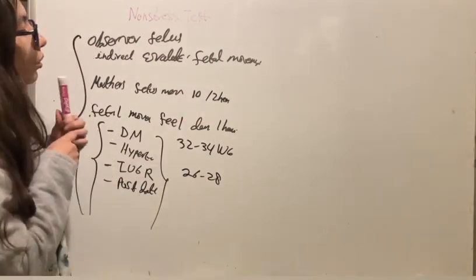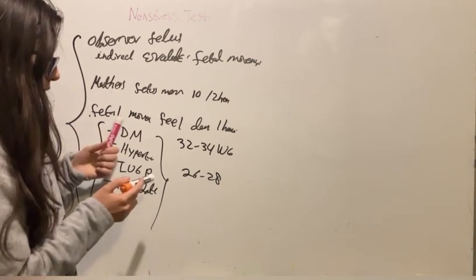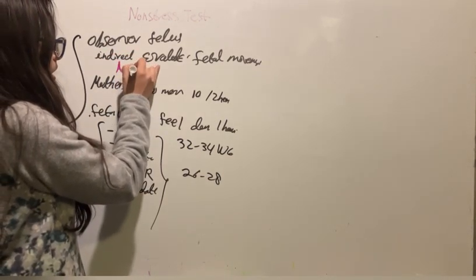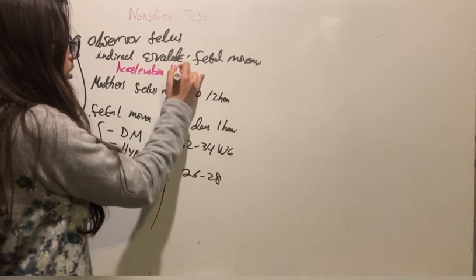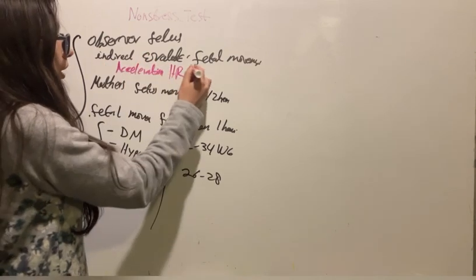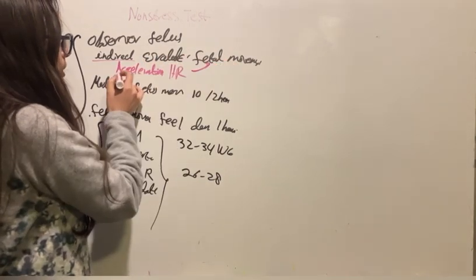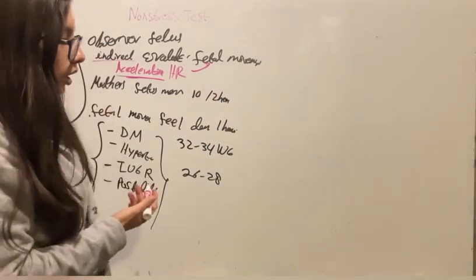Now, what does the non-stress test consist of? We are going to measure the acceleration of the heart rate, which is in response to fetal movement. So it's an indirect way to evaluate fetal movements. If we have acceleration, this probably is because the baby is moving.